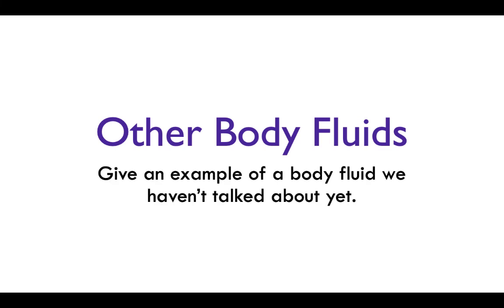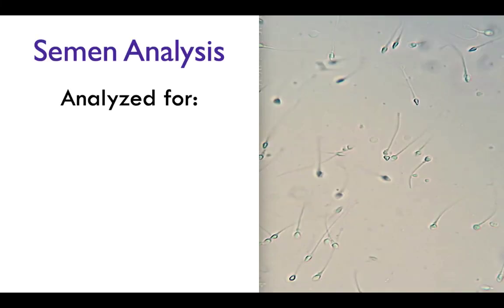The other body fluids that I'd like to talk about will be semen and amniotic fluid. And we are going to just briefly discuss semen analysis. It's actually quite an intense procedure in terms of analyzing sperm. The reasons why we do semen analysis is, one, for fertility or infertility issues. So if we have a fertility specialist up at Aspirus, I know they have a pretty involved analysis lab up there because of that fertility specialist.